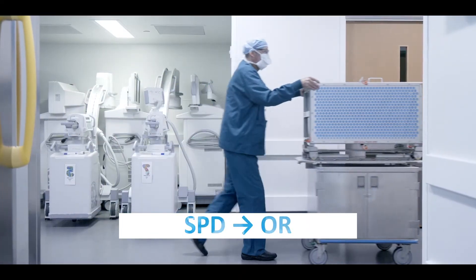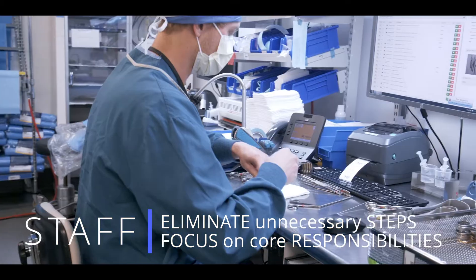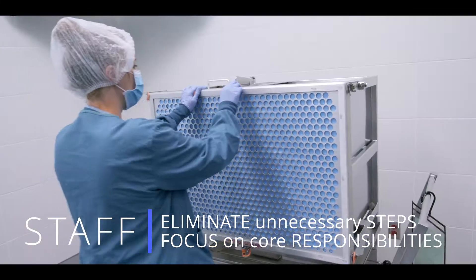The turbid pod is a game-changer in efficiency for our total joint turnovers. It's been a staff satisfier with both our SPD and total joint team.